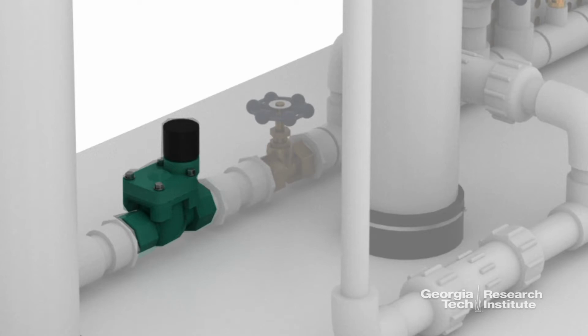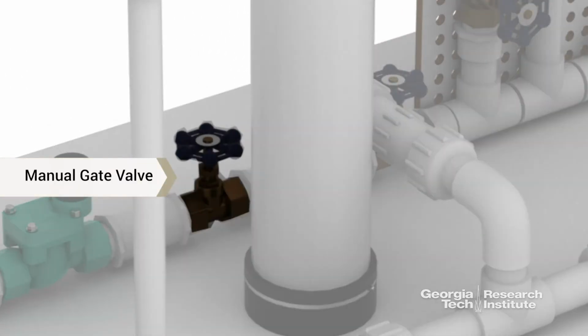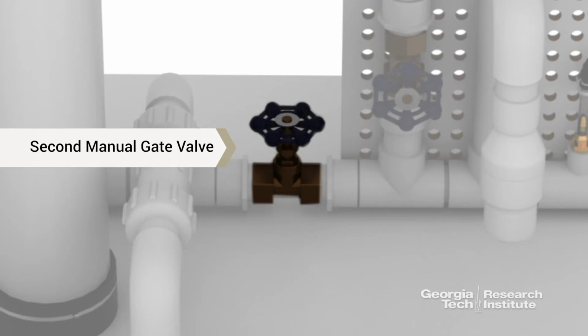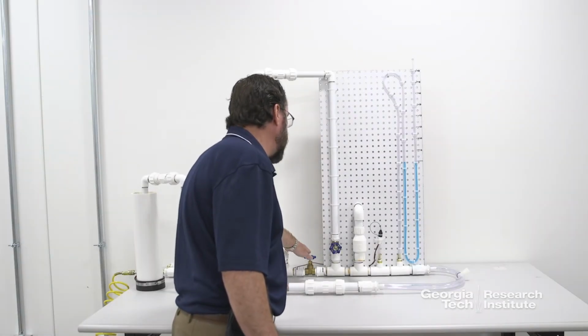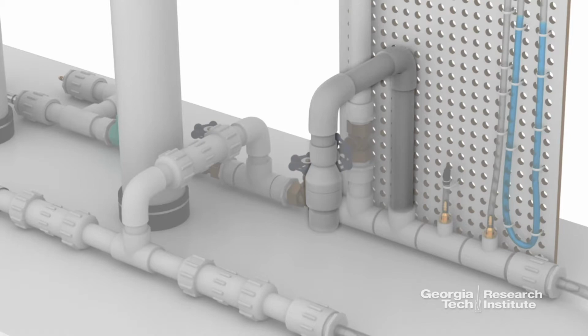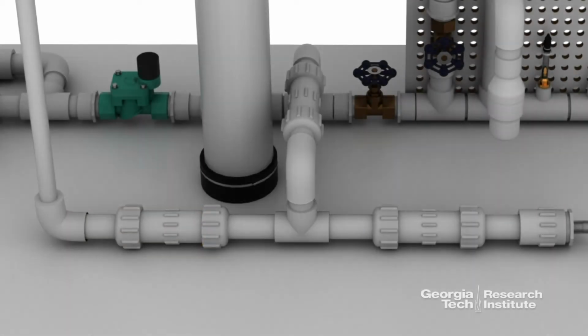The next component in the system is a manual gate valve, and we use that to drop the pressure a little bit further. And then we have a third valve, second manual valve, third valve in the system. We set it so that we maintain a higher pressure in this part of the system than we have in this part of the system. The reason we do that is we need high pressure in this area to close the pinch valve, and I'll explain that in a minute.